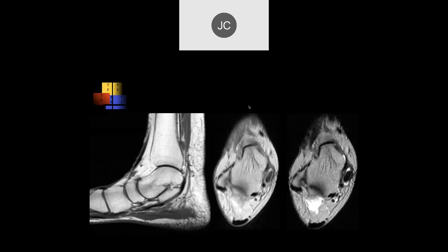On the sagittal image on the left, we see flat foot deformity. The posterior tibialis tendon, shown on the images on the right, is thickened with some tenosynovitis and maybe some moderate tendinosis.